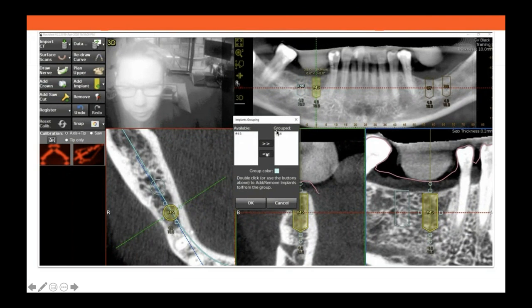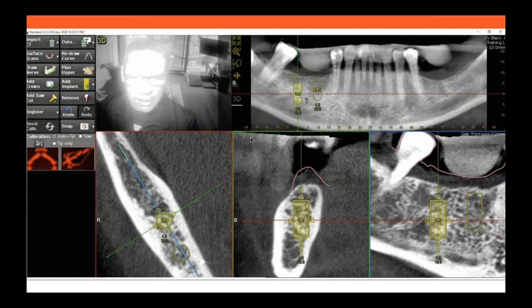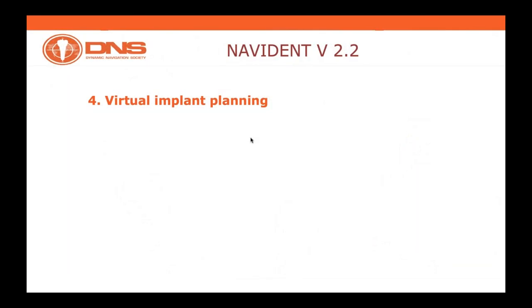From the properties, you can copy an implant, generating a copy. You can then set that copied implant parallel to the original — for example, parallel to number 45 — generating consistent angulations within your planning. You can also group or ungroup implants together. By clicking group/ungroup and selecting available implants — in this case number 45 and number 46 — you can move two grouped implants together simultaneously and change their color. When ungrouped, you can work on each implant individually again.